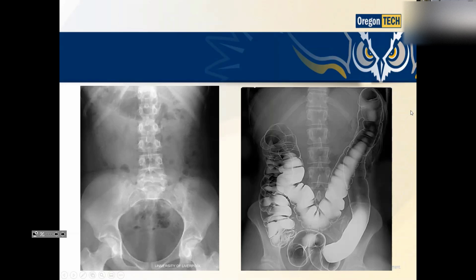So that's why we would have a barium enema here. This is a double contrast barium enema, and all of a sudden we have a high contrast between the bowel and the other soft tissue. What does double contrast mean? Good question. See the air here that's darker? They pour in some barium, that's the white, and then they fill them up with air. You have a little bulb, like a blood pressure cuff, and you just pump them up. And then you roll them around on the table.